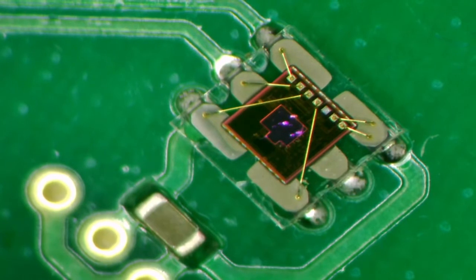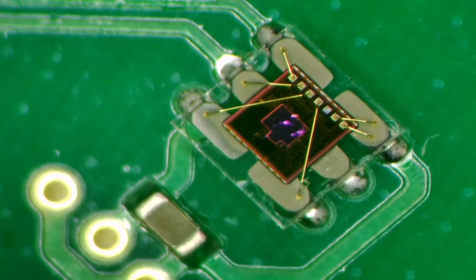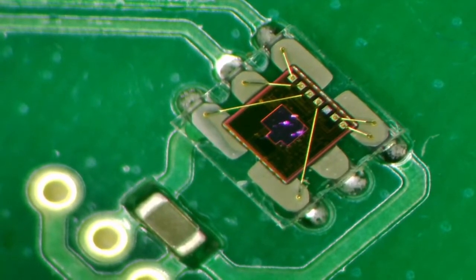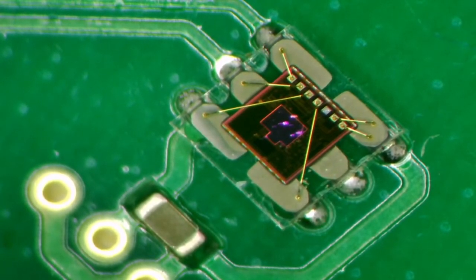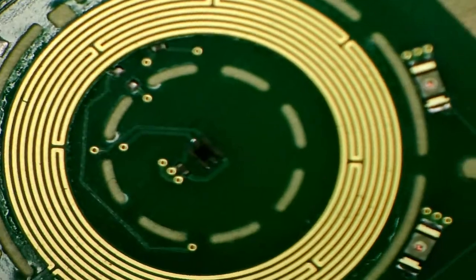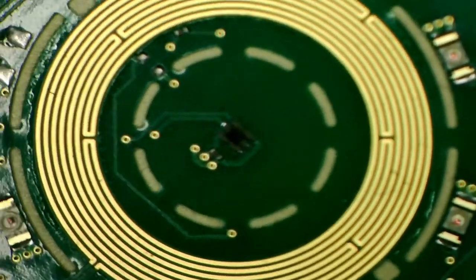And if I were guessing, I would say the LEDs around the bullseye illuminate the processed chemicals, and then this chip in the center is looking for particular colors of fluorescent or otherwise colored light, and from that decides whether you are positive or not.